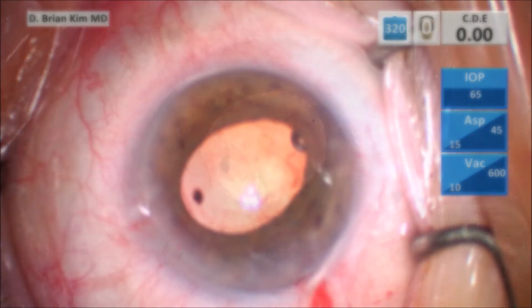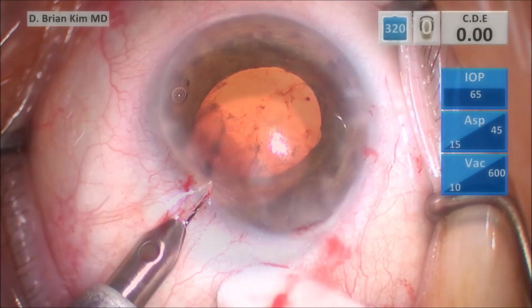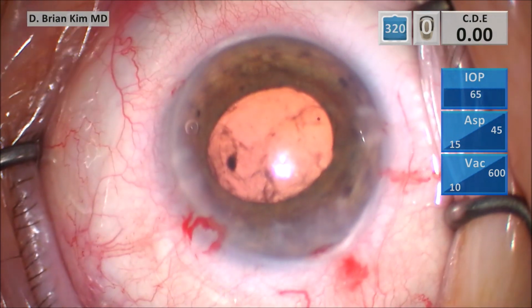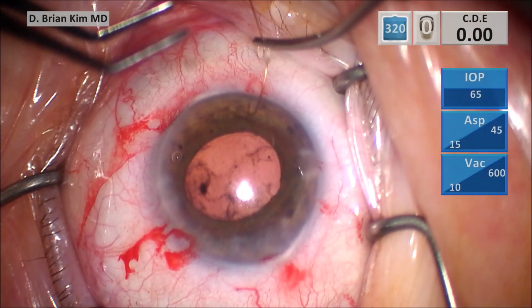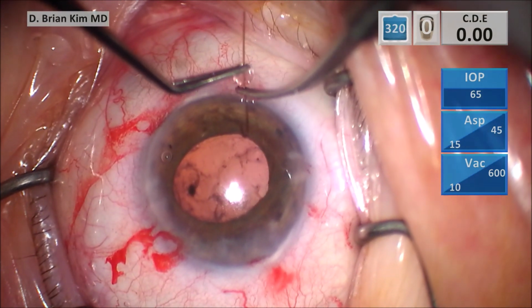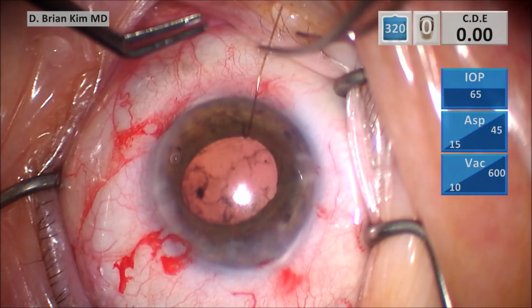So I go ahead and make some extra incisions here, and I'm doing that for my iris hooks. I want to really make sure that this bag is really healthy, and I'm considering placing a lens into the capsular bag if I can. And of course, I'm going to do that. I'm going to place a single piece acrylic lens within the bag. So go ahead and place each iris hook.